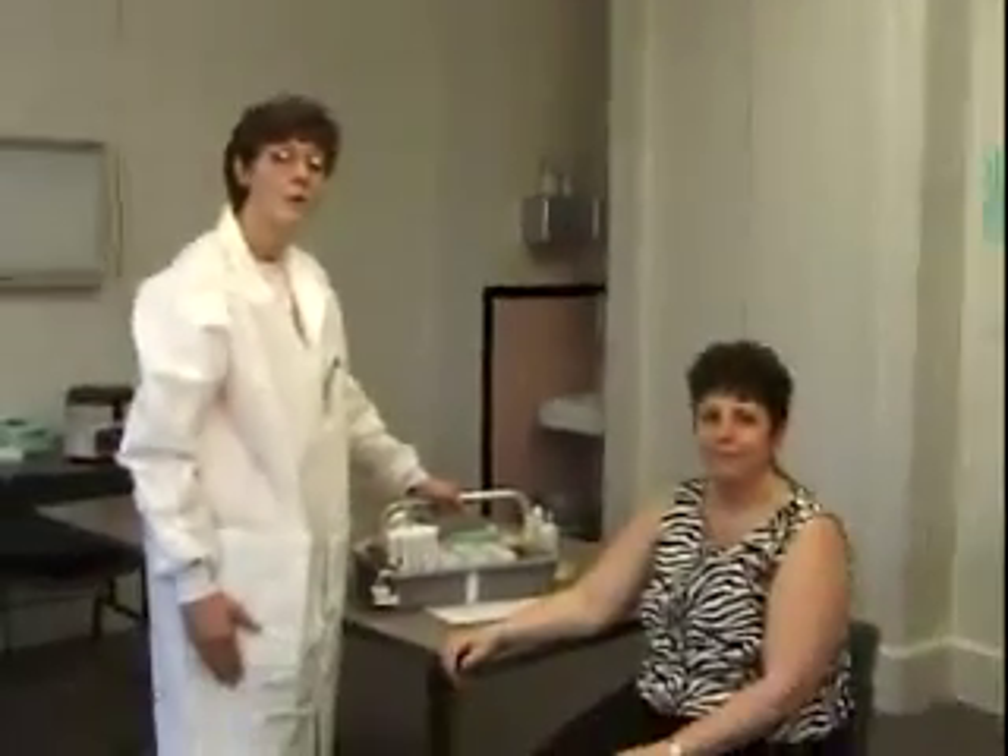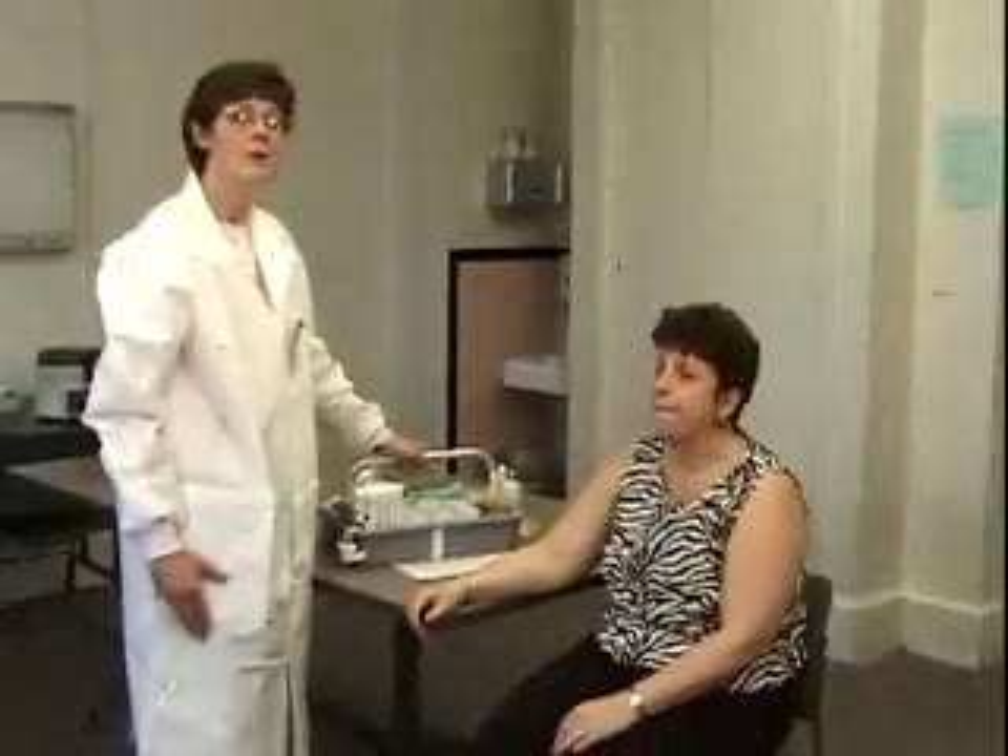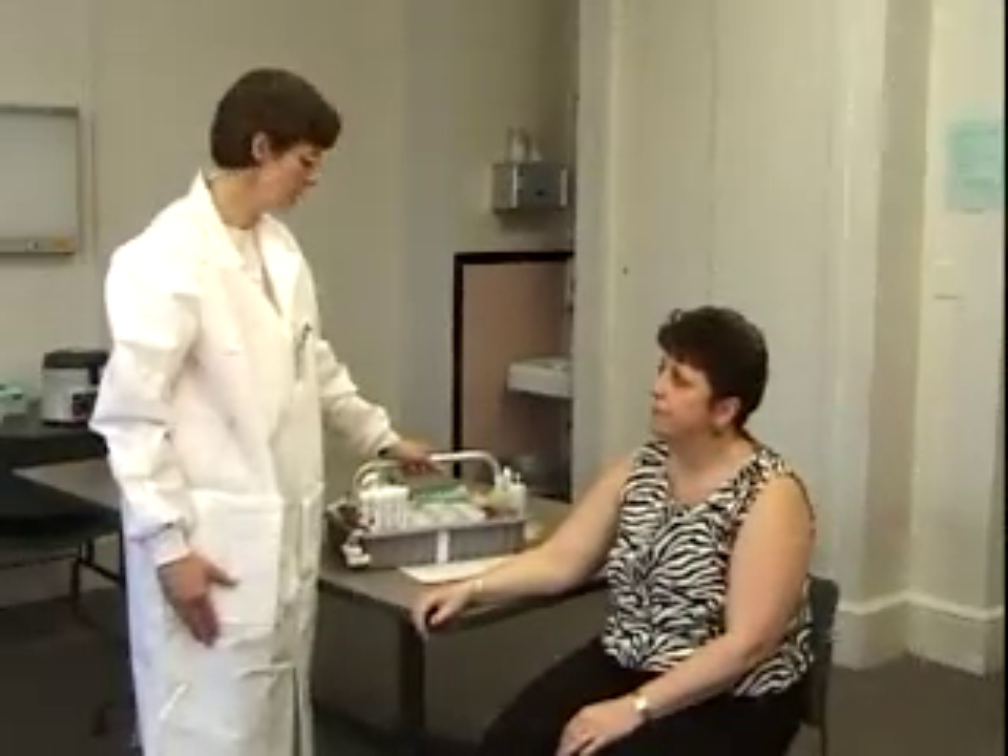Hi, my name is Kathy Toms and I'm from the medical laboratories, and this is Holly Bradley-Carter. We're going to make a film today on the actual procedure for drawing blood.